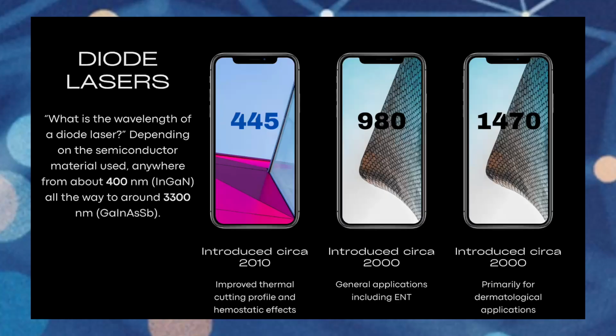Now, there are lasers manufactured, probably all in the same eastern part of the planet, that don't have this cutting you off at 10. So you get a 3-meter fiber, and you can just calculate. You lose a few millimeters every time you use it, and you can probably use this for months to years, depending on your frequency of use, before you have to purchase a new fiber. You just have to avoid breaking it, that's all. So you have to be careful with it. It's a thin fiber optic cable.